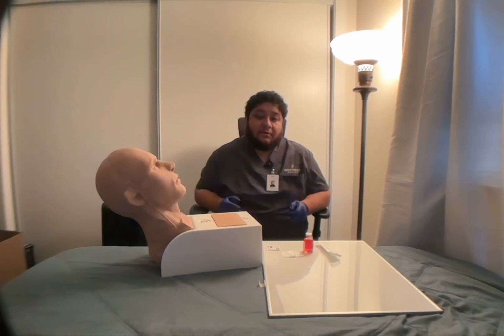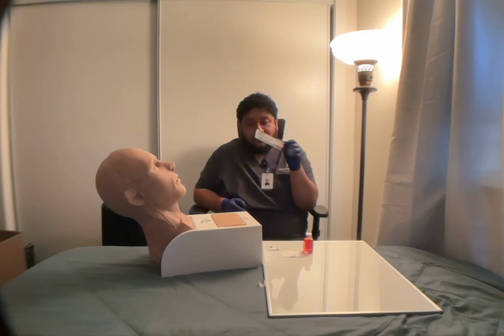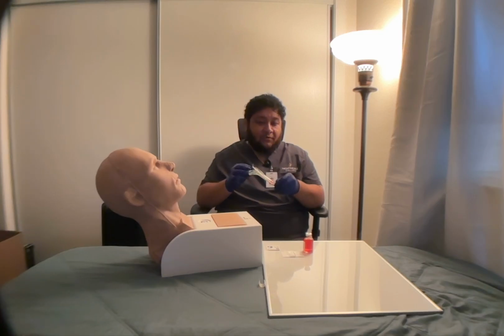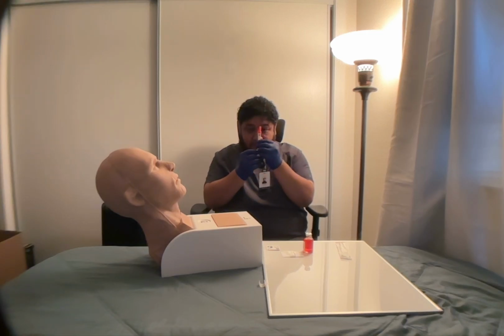Okay, so the syringe that I have here is a 1 milliliter tuberculin syringe with a 25 gauge and a 5/8 inch needle. I'm going to remove the syringe from the package, and I'm going to fill it up to 0.1 milliliters of air. Alrighty.